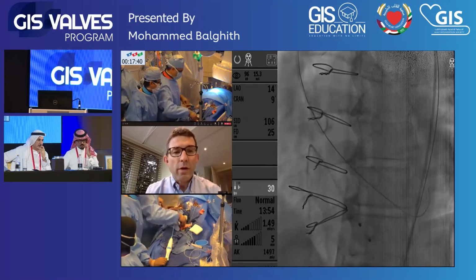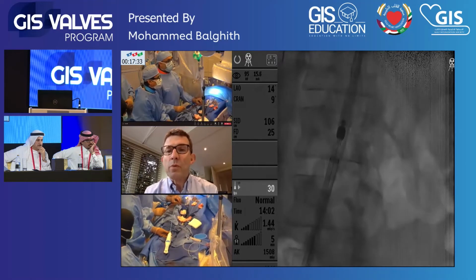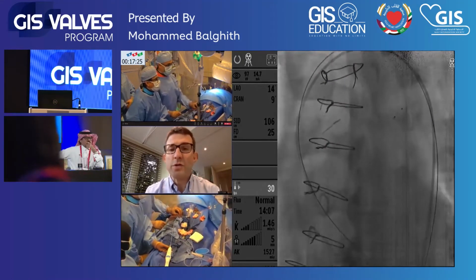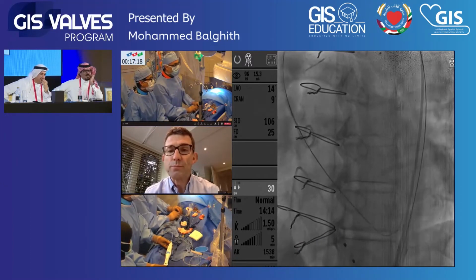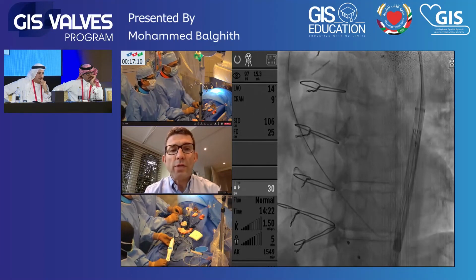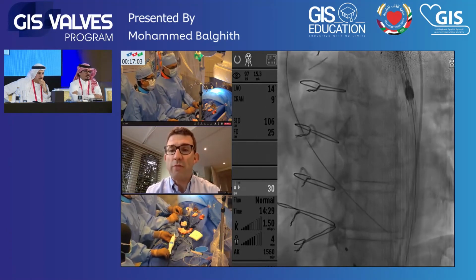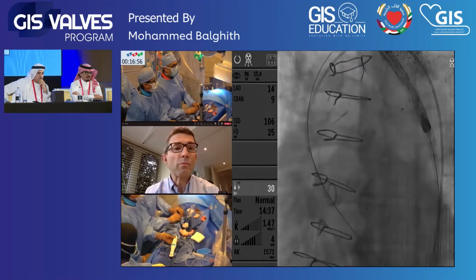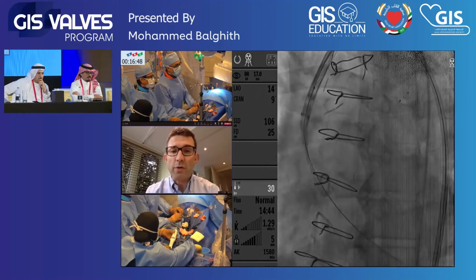Yes, Dave, do you have any comment? That appears to traverse the common iliac very nicely. I think we passed that. The fact your sheath is into the hub will tell you that you traversed into the distal aorta. We didn't have much resistance this time. The delivery system of the Navitor, I think, is probably the most deliverable system commercially available currently. You can see the descending aorta. You've traversed that very smoothly and expertly. Go ahead.